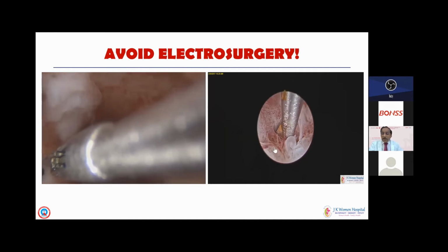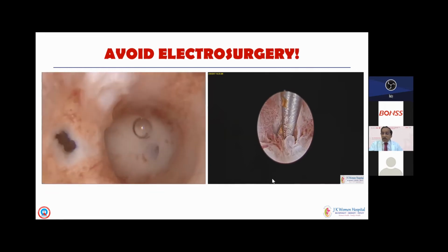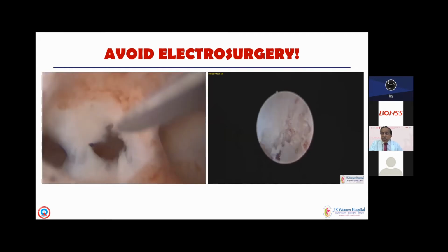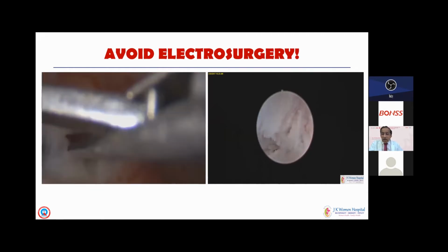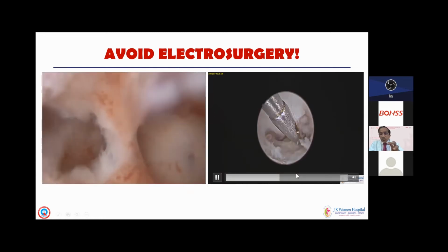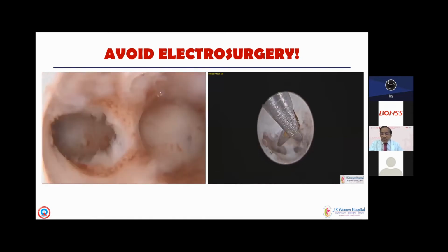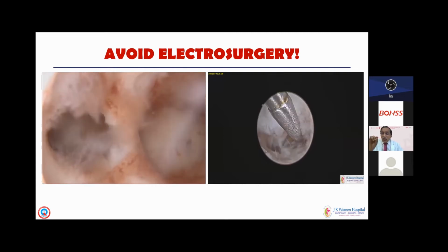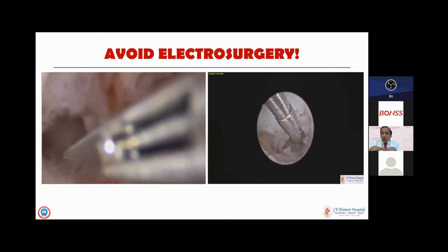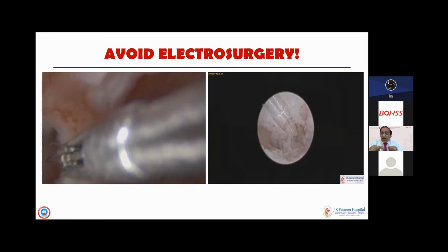Whereas on the right side, you see the video where a woman has come after 3 years of her temporary procedure, where you can see even the internal ostia is obliterated. Means there is zero cavity. And here, if you have to dilate it and use the resectoscope, you will wonder whether you're in a false passage. But use that scissors very judiciously. All the mucosal folds will lead you into the internal os, and you just open it up and use that scissors to occasionally dilate and lyse those adhesions.